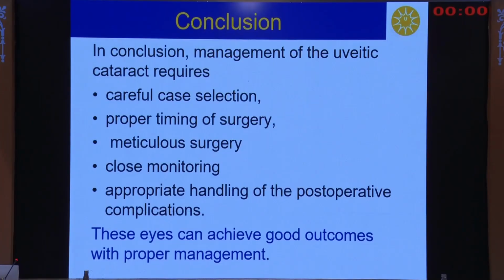So we conclude that the management of the uveitic cataract requires careful case selection, proper timing for the surgery, meticulous surgery and close monitoring, and appropriate handling of the post-operative complications. With proper management, I have achieved good visual outcomes.